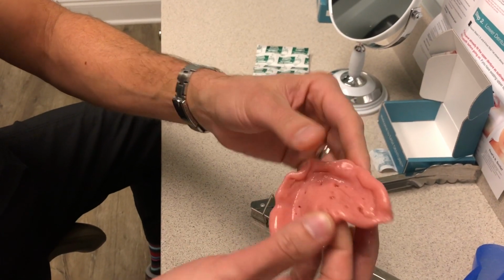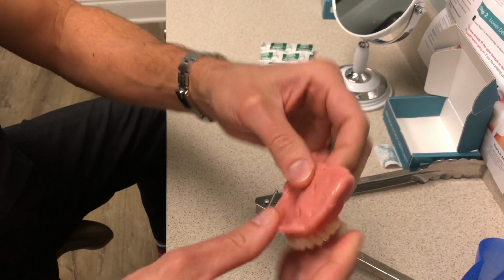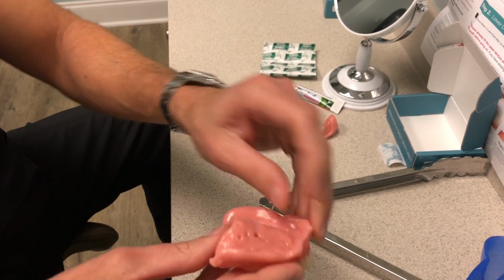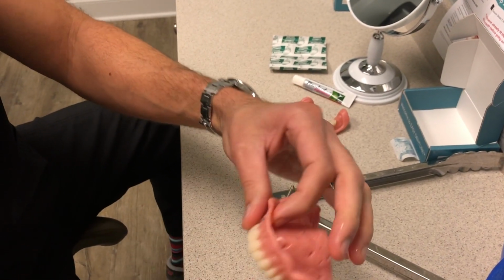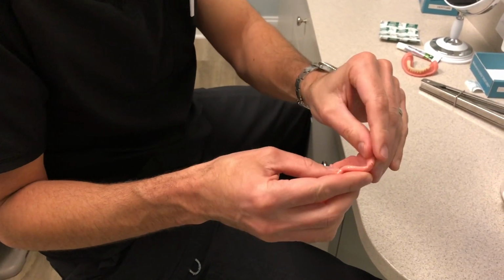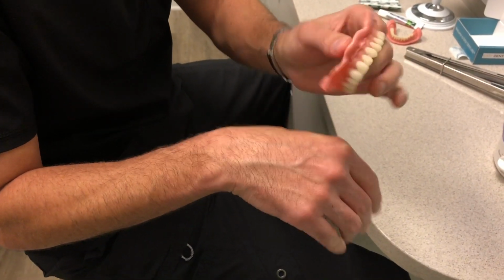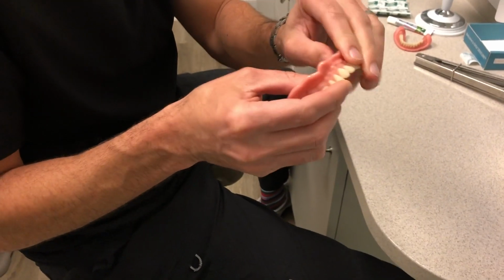I could give it a palate. You can do everything there, but need to let it cool down for 60 seconds before I really start to mess with it and decide to put it in my mouth. So give it a few seconds to cool down. So it's been about 50 seconds now since I've had it out of hot water, and I could feel it, and I'm gonna put it in my own mouth, and, you know, kind of put it on my skin, make sure it's not too hot.